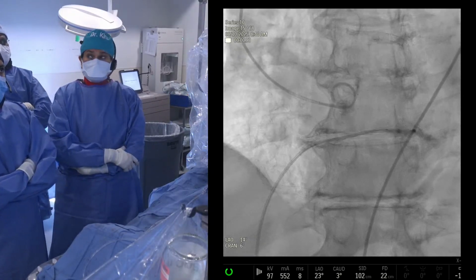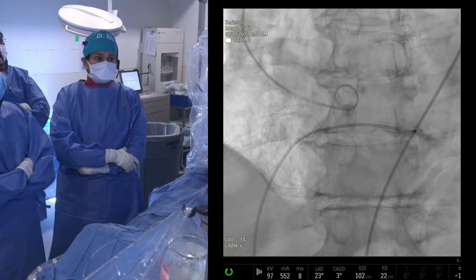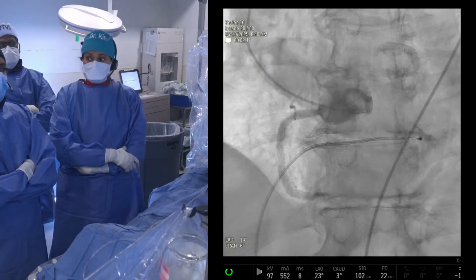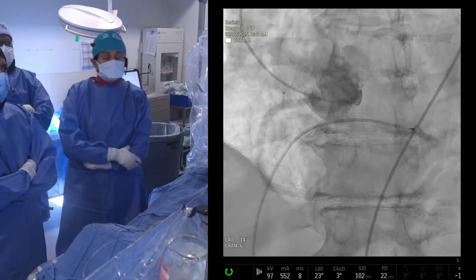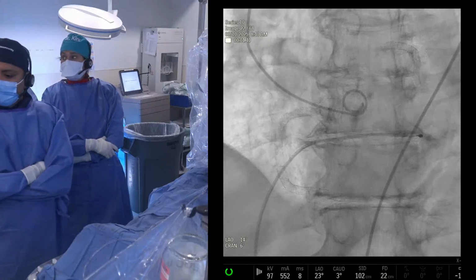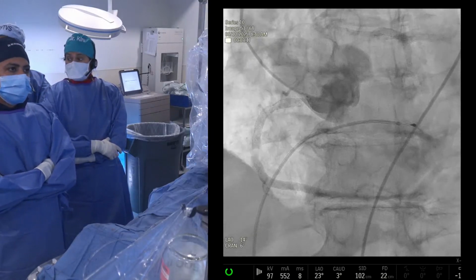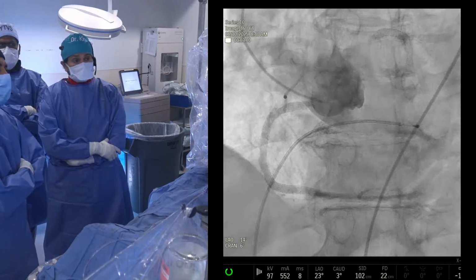So we always look at the root aortogram to finalize our decision sometimes, even though we have the CT analysis. Remember, sometimes CT is also inaccurate, meaning that if there's motion artifact, the contrast is inadequate. So you have to also look at the angiogram, aortogram to confirm that. Parasuram, what is your take?